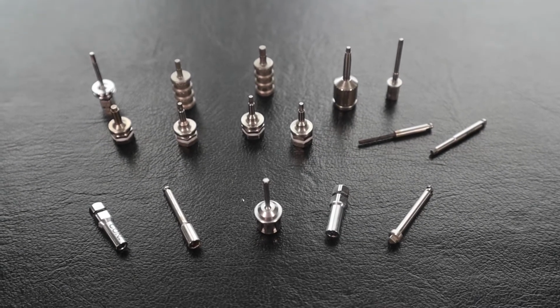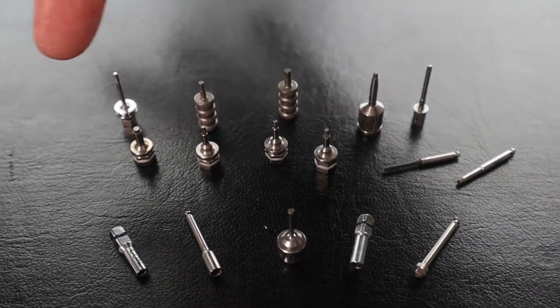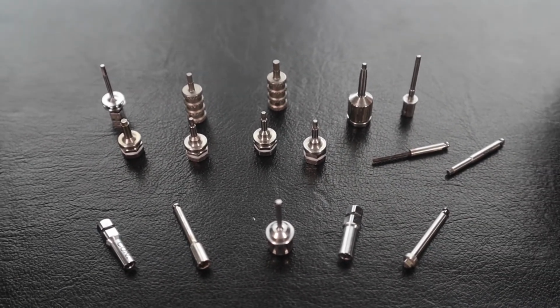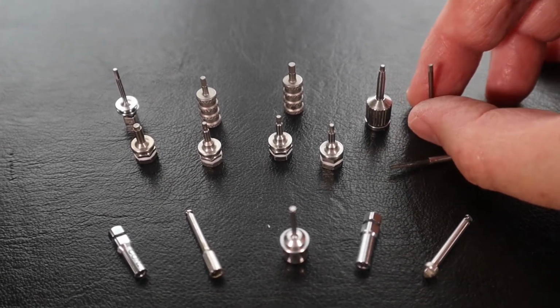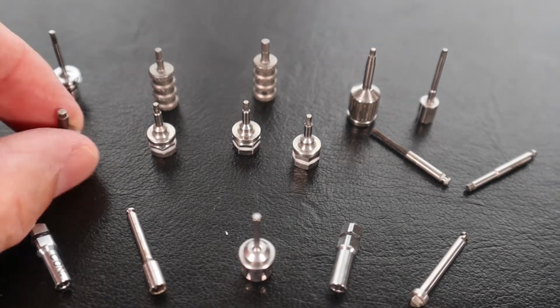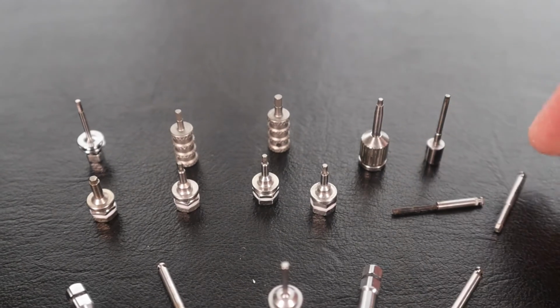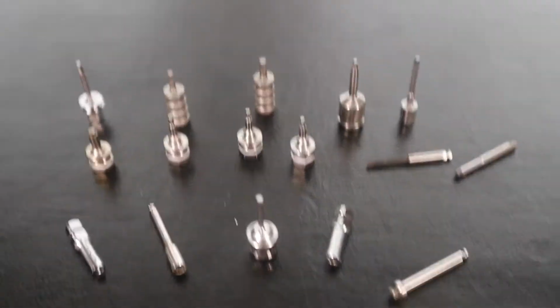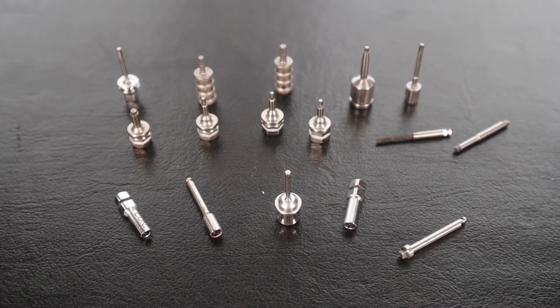These are the various drivers I have in my collection. Quite a vast array. The top ones here are basically all hex drivers, kind of like a standard Allen head key, but they come in all different sizes. Some are small, some are kind of large, like this one for instance, and then some are so close to one another that it gets frustrating, especially if I have a patient that comes in with an implant brand I'm not familiar with. Thanks to Google though nowadays, we can Google it and find out what size they use.